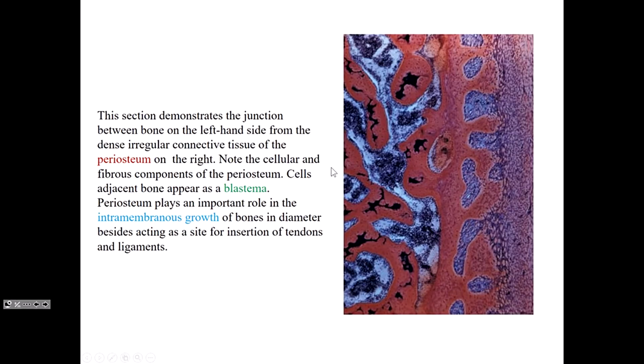Okay, so now let's look at bone formation and intramembranous mechanism. So why is this intramembranous as opposed to endochondral? Well, it's intramembranous because we have a periosteum of mesenchymal cells. Here's our periosteum. And if you look here, see these cells, see how they've all got plump, they're kind of fat? That would be a bone blastema. These are the forming osteoblasts that are fattened up in preparation for attachment to the bone proper, where they will secrete the osteoid. Any questions?